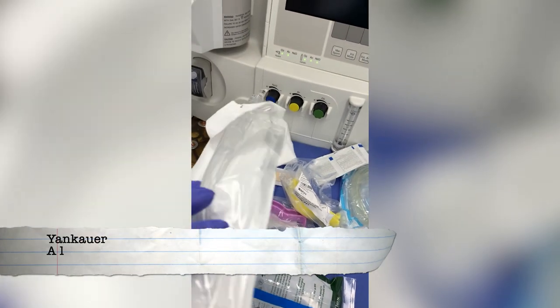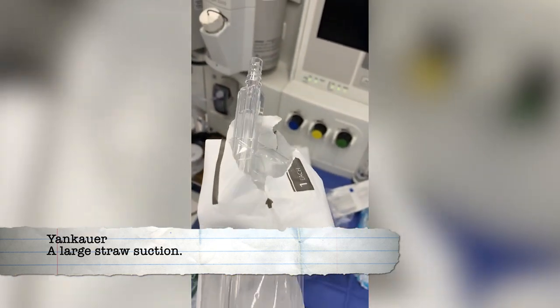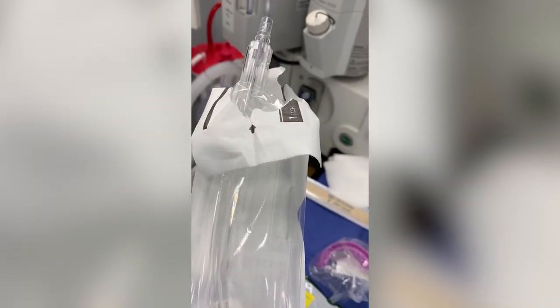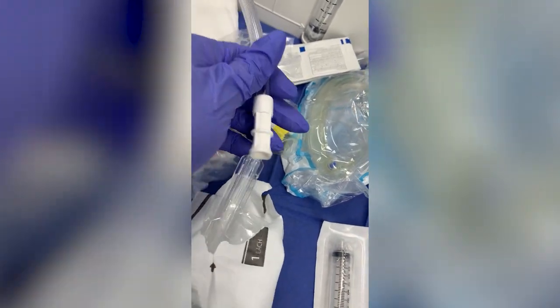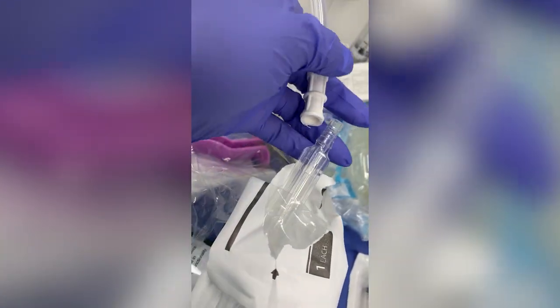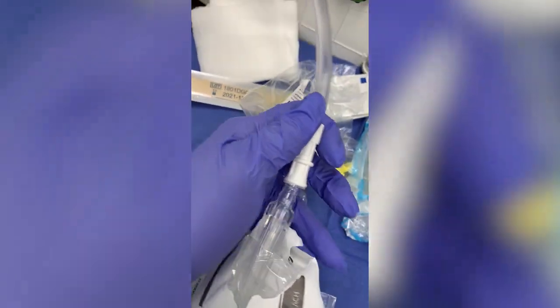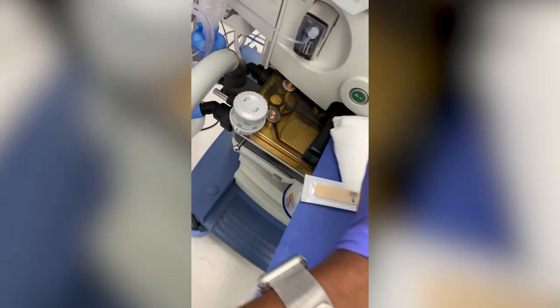Okay. This part is called a Yankauer suction. So it's like a large straw, really big opening so that you can get a lot of material out of the way as quickly as possible. And you just connect this up to your tubing, suction tip goes right like so, and you're in business. You can hear it starting to suction the plastic here. So that's what you want to hear when you know your suction is good and ready to go.